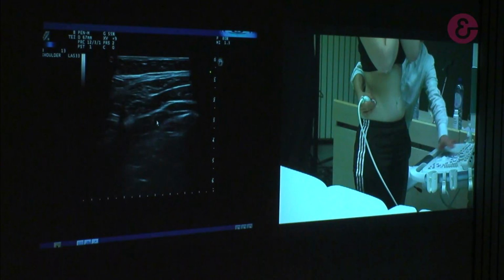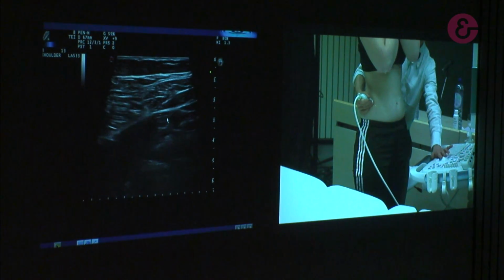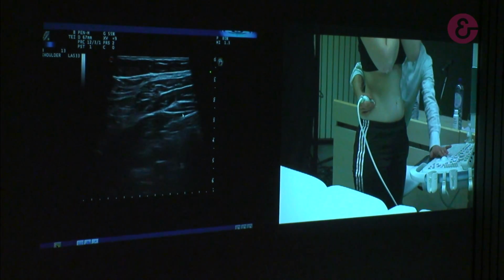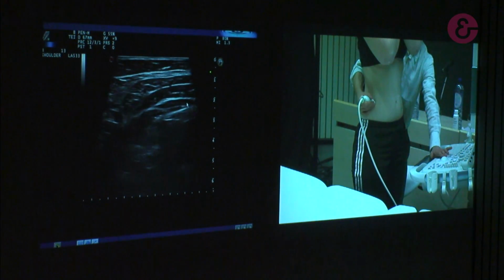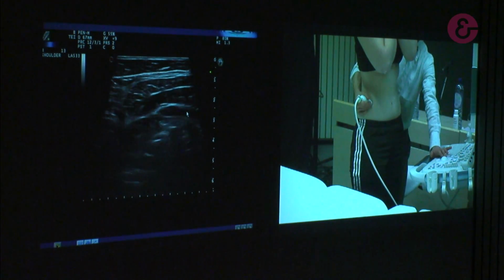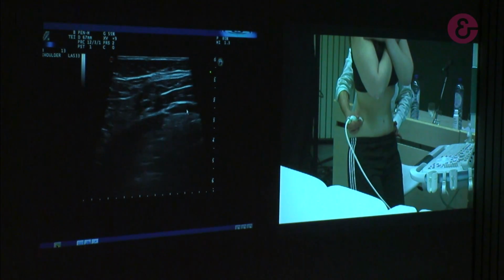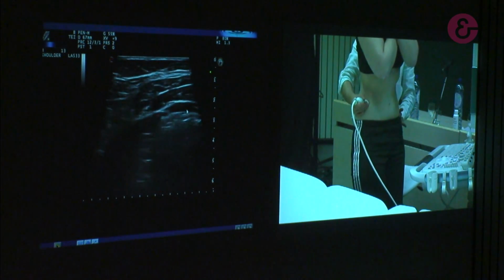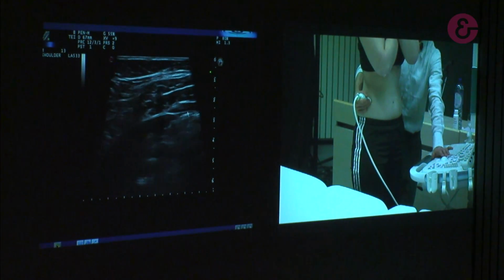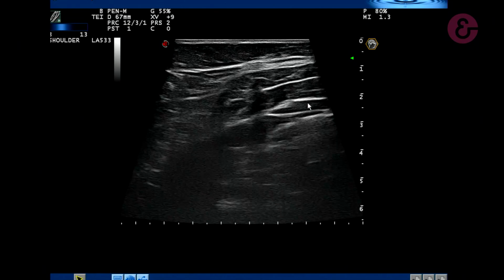So now here is the posterior part of transversus abdominis, as the fascia will arrive to the lumbar vertebra. So now I ask her to breathe in, breathe out. So, stop breathing. Very good. And now we can start, so squatting and come back. So it's important that transversus abdominis will be on during the exercise, during this functional movement.